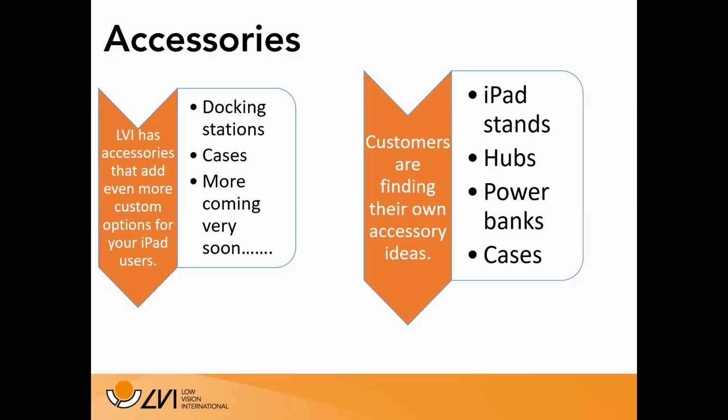You heard over and over again that these devices connect with your iPad through a USB connection. One of our products, the iTab, actually has a hub built into it so you can have multiple USB-C ports, so you can have your iPad connected to power simultaneously with having your camera connected as well. So if you don't buy that iTab product and you just want to use your iPad and, say, a Magnilink S, well, what about a recommendation for a hub that you can plug straight into that USB-C, and maybe it'll give you the possibility to connect that camera and, say, a power bank.